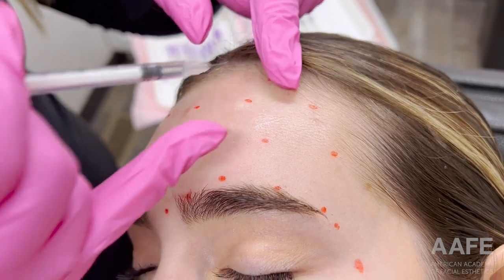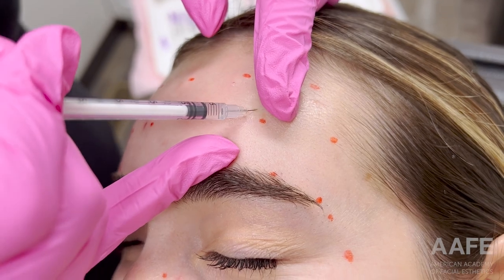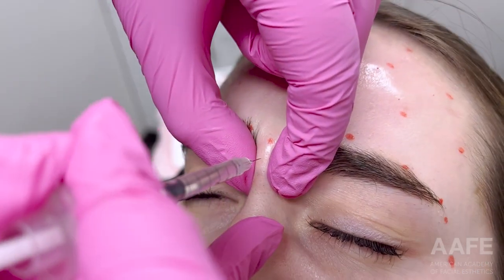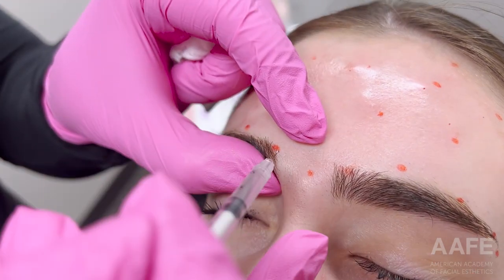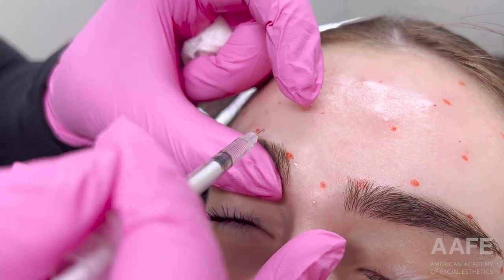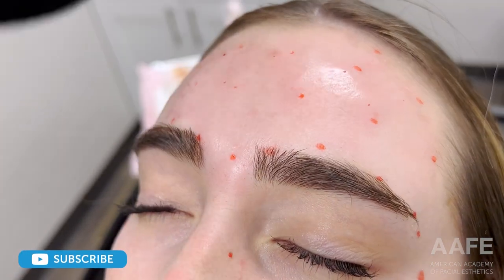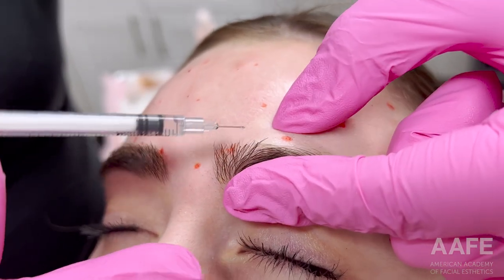Using the dry erase marker gives me an idea of exactly how many injections I'm going to do, making sure I'm covering the muscle all the way across to ensure the best distribution of product. You can see she has quite a few dots across her forehead, then moving into the glabella region — treating the procerus right in the center and then moving out to the corrugators on either side, always making sure to seal off that orbital rim.